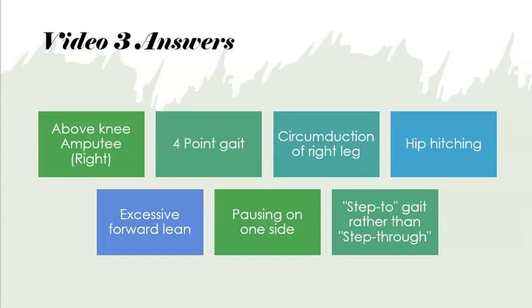And that's why you need to use the sticks more, so they can be in a more upright position, correcting that forward lean, having their center of mass over their base of support.